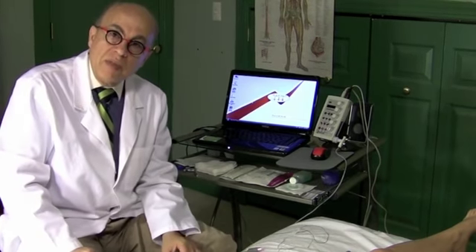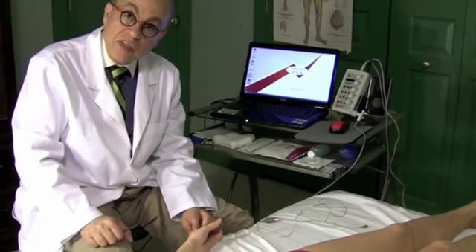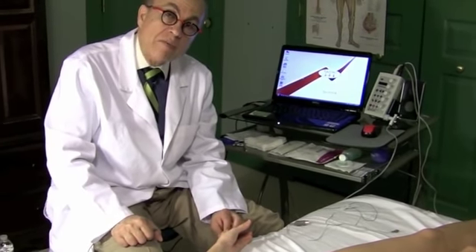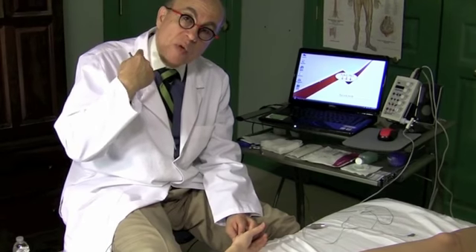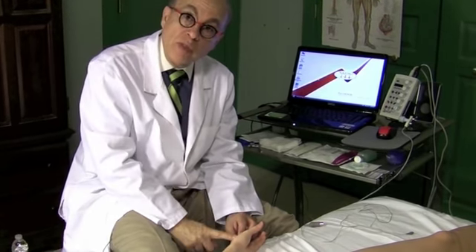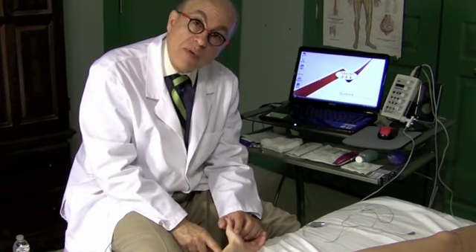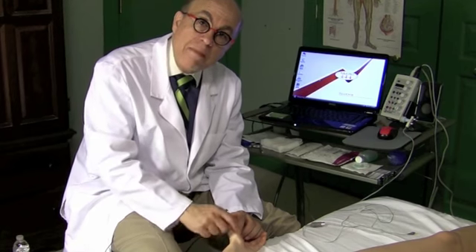The reason we do a combination of muscles, I'm going to give you an example. For instance, if we study the first dorsal interosseous, which is an ulnar innervated muscle coming from the C8 and T1 roots, that's the ulnar innervated muscle that may be normal or abnormal. Let's say it's abnormal. Then I would study the abductor pollicis brevis muscle. Now that's a median innervated muscle, also coming from C8 and T1.